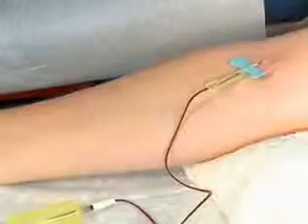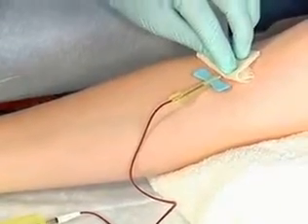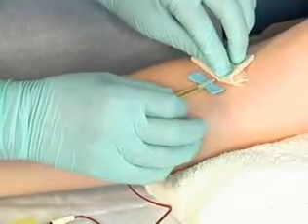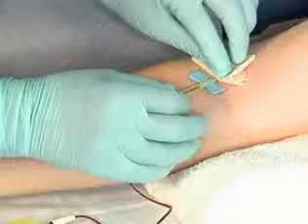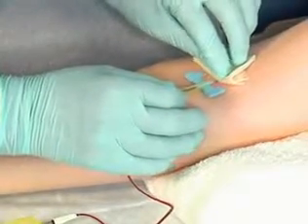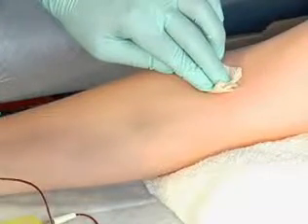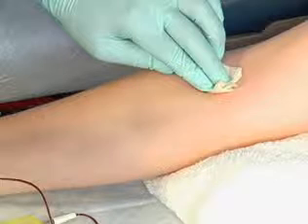Place a sterile gauze pad slightly above the puncture site. The gauze stabilizes the skin as the needle is removed. This prevents tissue movement and patient discomfort as the needle is removed. Grasp the setup just below the wings and slowly withdraw the needle at the same angle as that for penetration. Using the same angle reduces tissue damage.